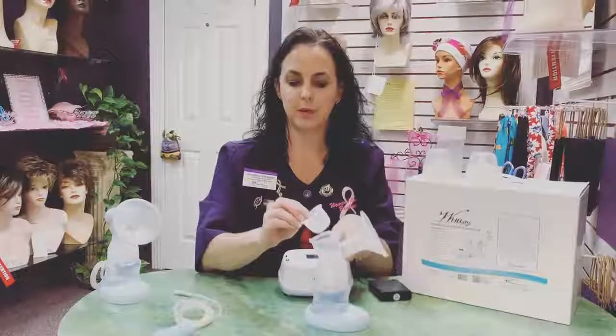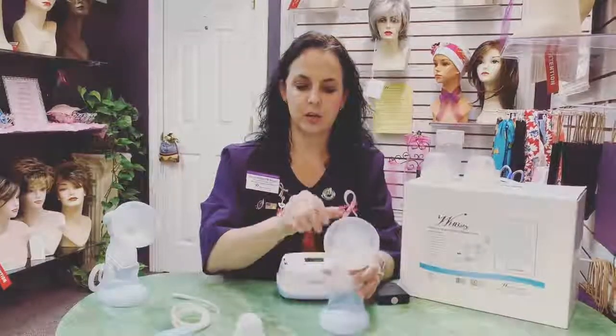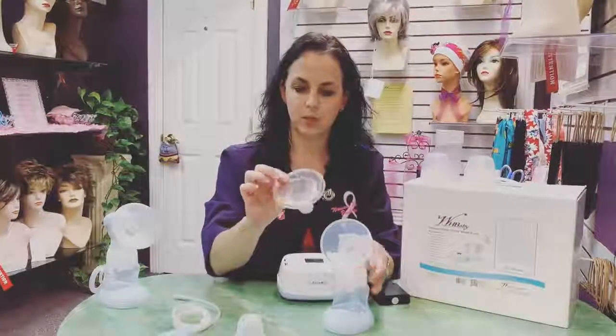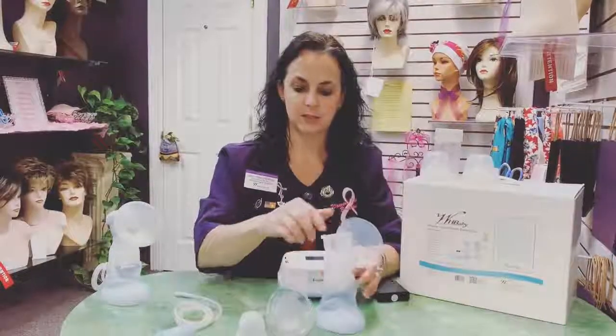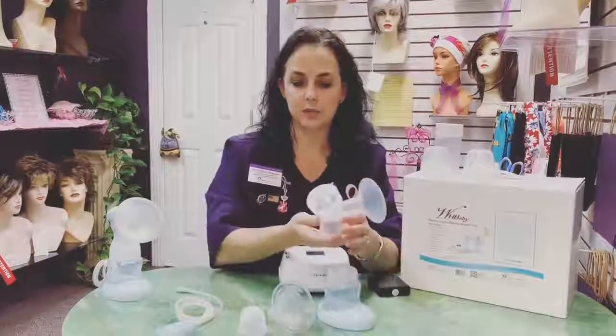You'll want to wash the bottom of this off. It will sometimes have a little bit of milk exposure from pumping due to excessive flow, and it may back up just a little bit. Gently wash that off with soap and water and let it air dry. You're going to do the same thing with your flange cover. You're going to take it off and wash it if you have any milk or residue inside here, just for sanitary purposes.